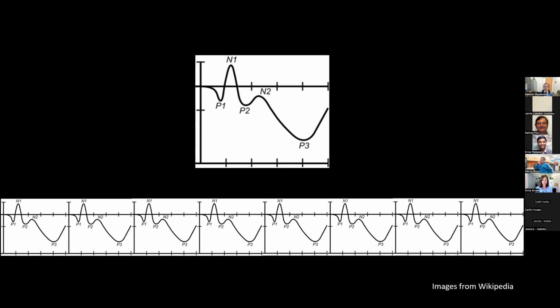But here is the definition issue. When we look into the ERP, let's say, starting from 200 milliseconds before and 800 milliseconds after the stimulus onset, is this 1 second ERP stationary or not? And the answer is, surprisingly, this is non-stationary, right? Because it starts from the baseline period, which is quiet and centered at 0, and of course it shows the brain's response to the stimulus or whatever the behavioral output.